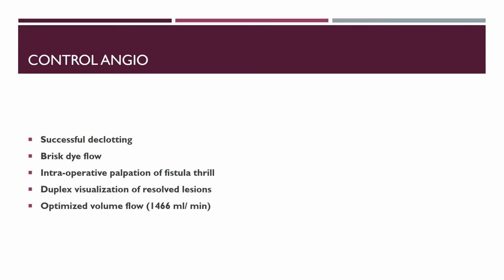Control angiography revealed successful declotting of the fistula. Brisk outflow. Intraoperative palpation of fistula thrill. Duplex visualization of resolved lesions. Optimized volume flow, 1466 ml per minute.